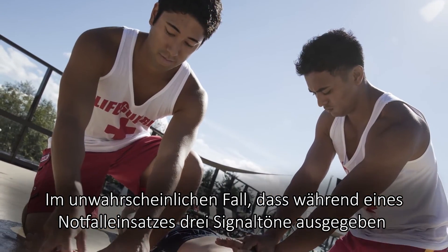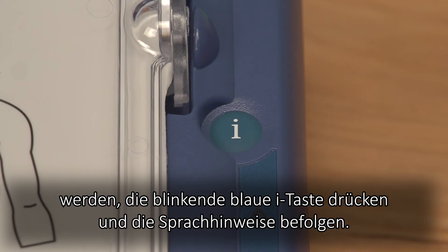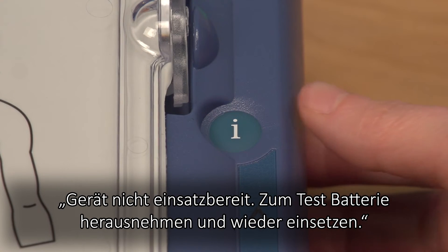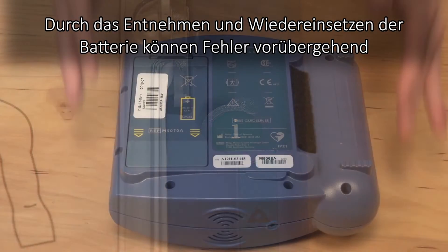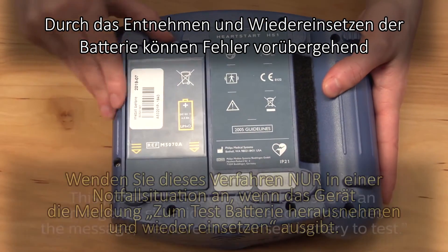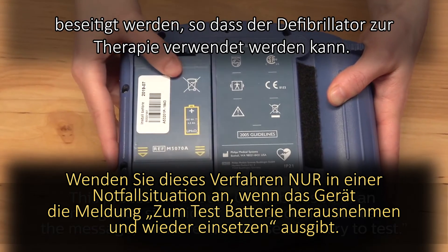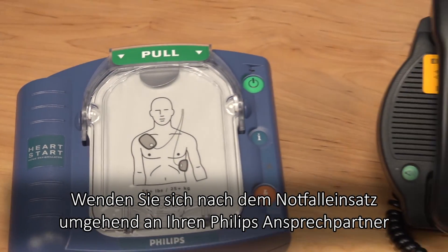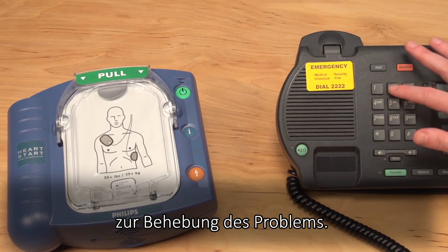In the unlikely event you hear triple chirps during an emergency rescue, press the flashing blue eye button and follow the voice prompts: "Not ready for use. Remove and reinsert battery to test." Removing and reinserting the battery during a rescue can temporarily clear some errors and may enable the defibrillator to deliver therapy. Once the emergency is over, contact Philips or your Philips representative immediately for technical support.